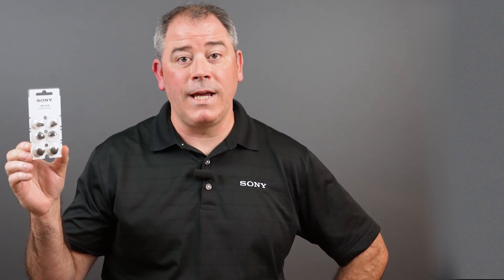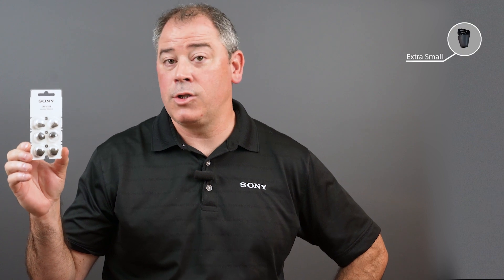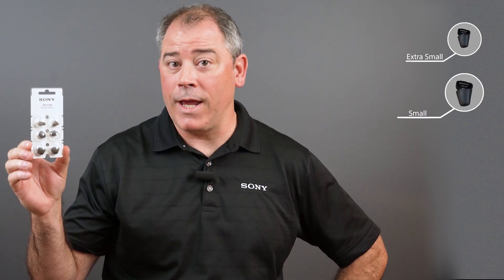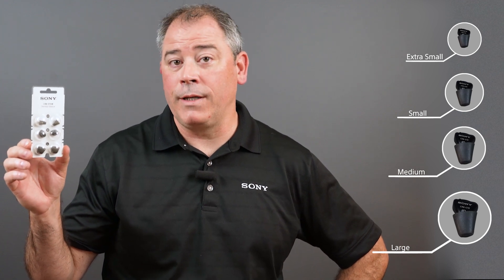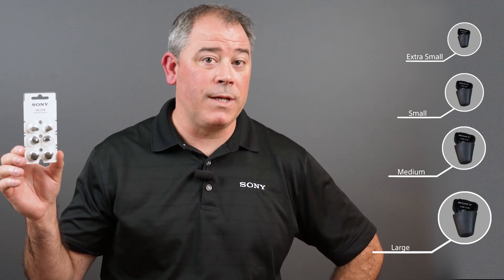Your package will come with four sizes: extra small, small — which is pre-installed on the hearing aids — medium, and large. You may need to try these out for a couple of days and see which one fits and feels best for you.